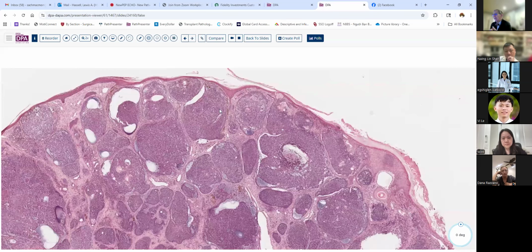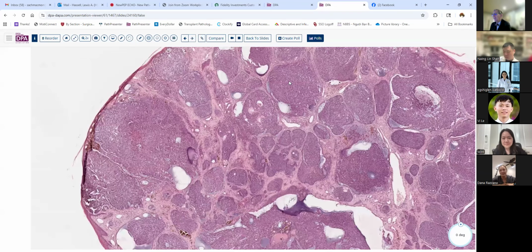There is one other thing that can occasionally be done in some of these circumstances if you don't have access to that red chromogen for whatever reason. There is what's called a melanin bleach procedure where you can take the block and submerge it for a period of time in a bleaching solution that will pull out the melanin pigment and allow you to then restain the tissue with the standard reagents.